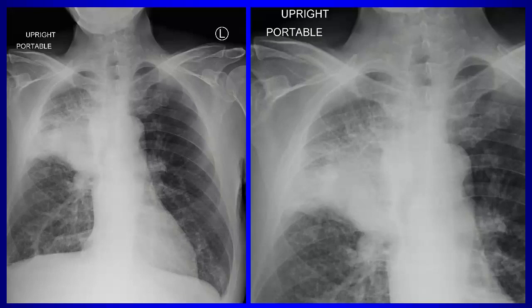Well, not so much the enhancement of the nodes, but first of all, do you want a PE CT in a case like this? Yes or no? No, right? Do you want a non-contrast CT? No. Why do you want a contrast? Why do you want a post-contrast CT then? I mean, just to see the anatomy better.